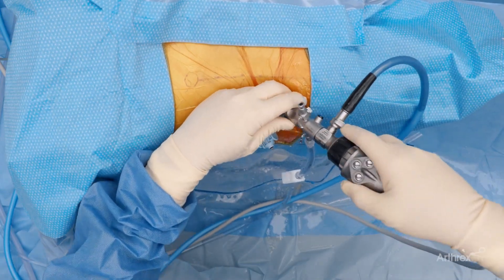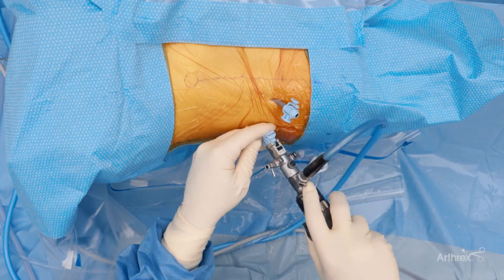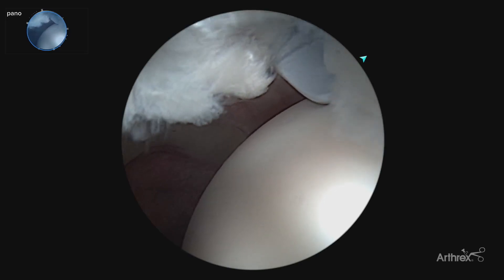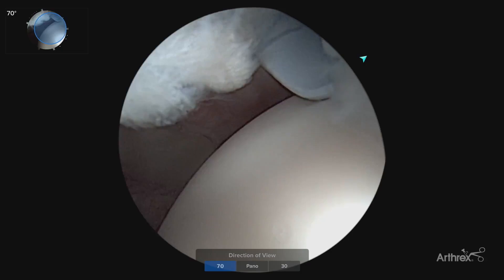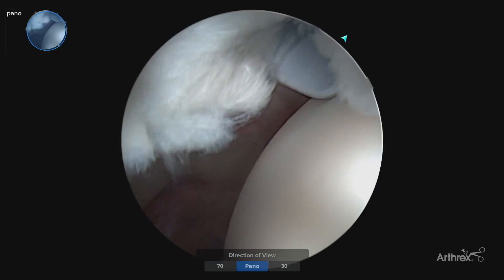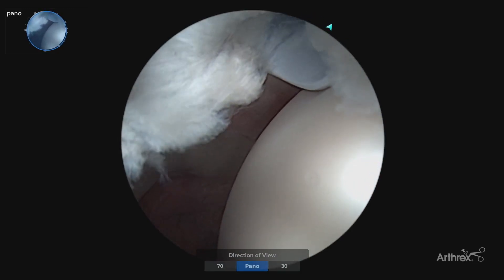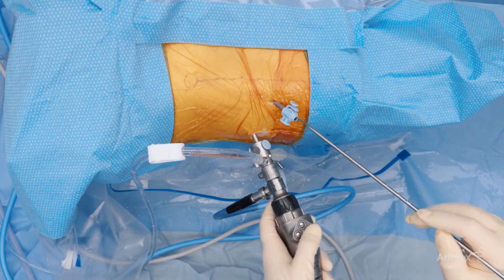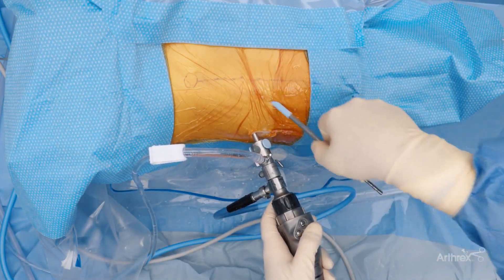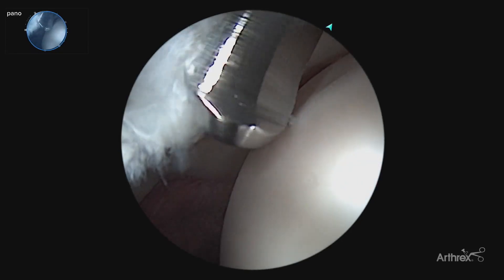We are going to now switch viewing portals to our anterolateral portal. We are utilizing the new Panascope for this. Right now we have it on Panascope mode. We can also switch it to a traditional 70 or a traditional 30 if we'd like. For this case we are using the Panascope version. Now we are ready to easily finish off our interportal capsulotomy with minimal steps, which again is decreasing our traction time and helping out with our OR efficiency.